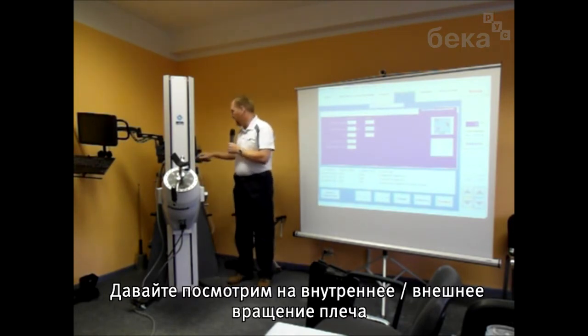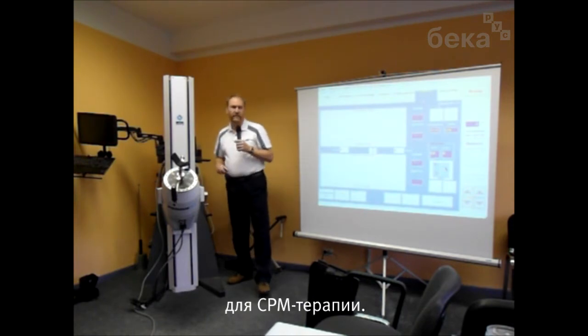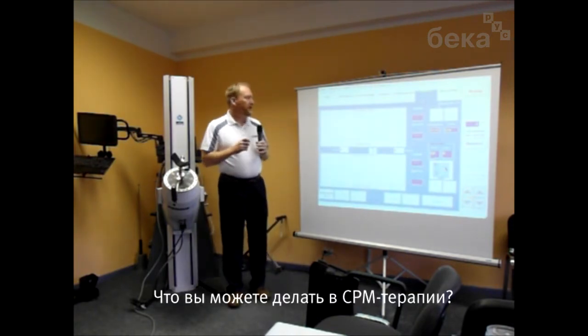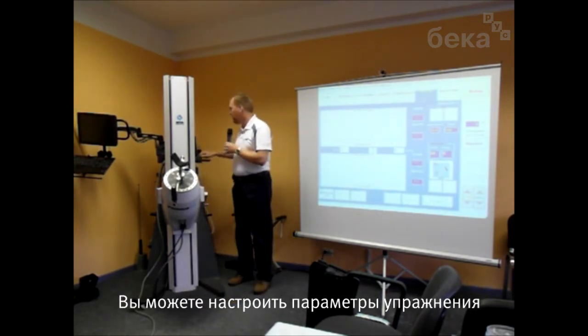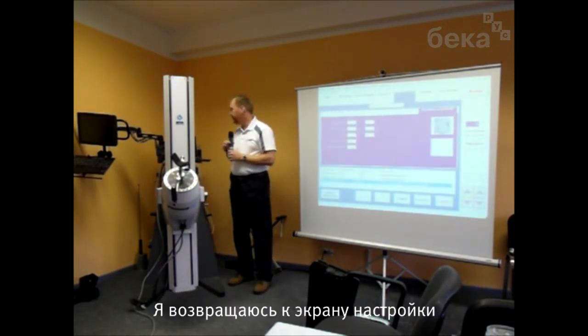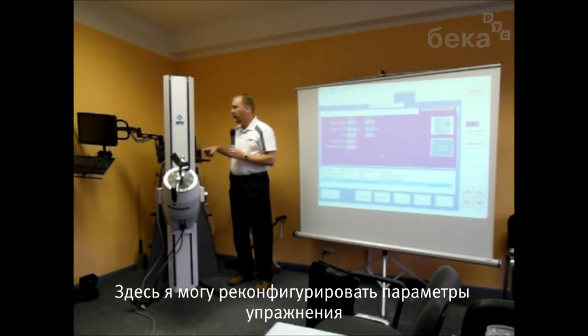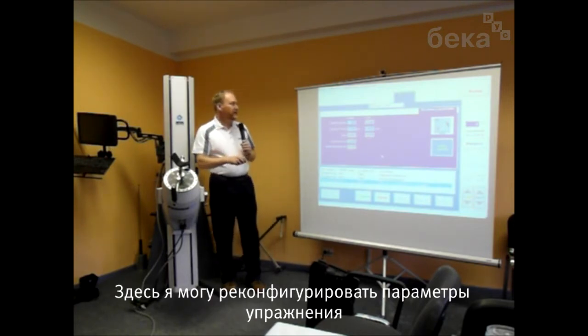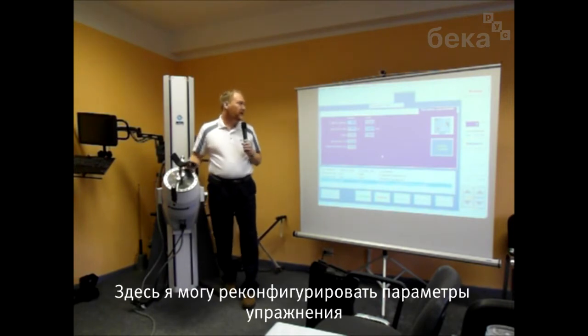So let's look at shoulder internal-external rotation for CPM. So one thing that you can do in CPM is you can control the parameters of the exercise. So if I go back to the setup screen, I'm going to choose the modify option, and then that will let me make changes to the configuration of how the exercise will proceed.